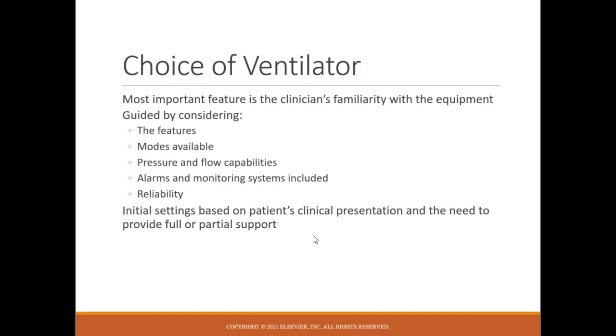I think that this is the glaring reason why not to maintain a relationship with the company. There have been instances over my 20 plus years in respiratory therapy where the hospital I was working at or the department I was managing, we weren't being supported well by the company that we were using for mechanical ventilators. And if you think about the absolutely astronomical budget number that is required to purchase all of those ventilators, you feel like, hey, we deserve some really good customer service.